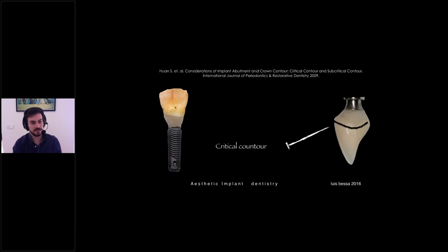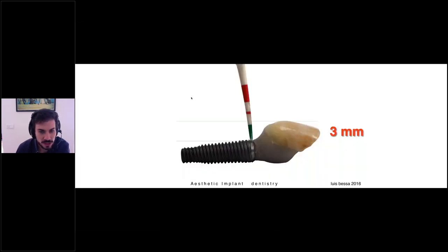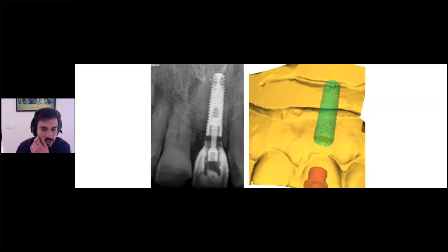There is no better provisional restoration than the whole veneer of the tooth of the patient. Every time I'm able to save it, I save it to do my provisional restoration. The provisional restoration should respect all the spaces, not move the shield, and not move our tissue away. And this is the relationship of the implant placement to the shield.